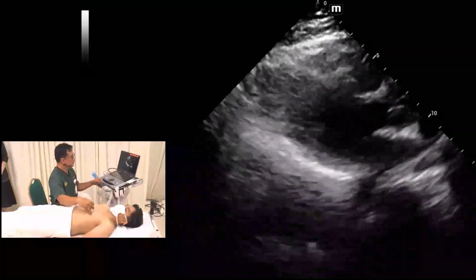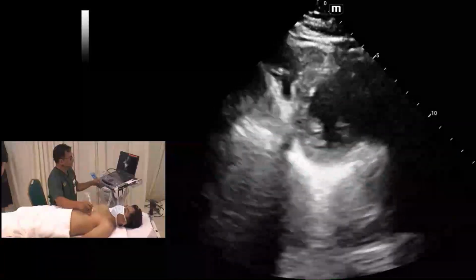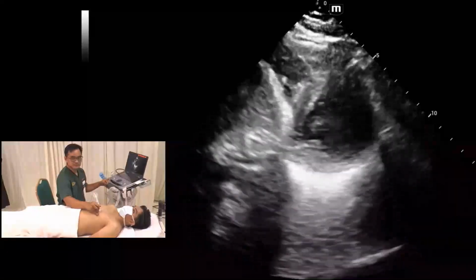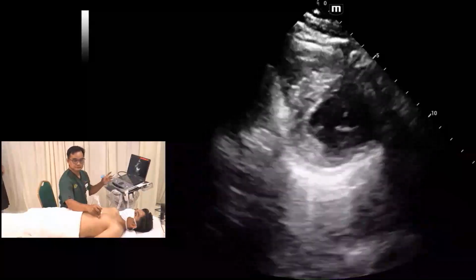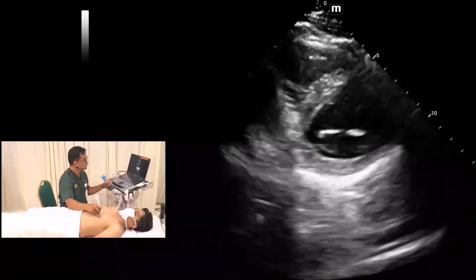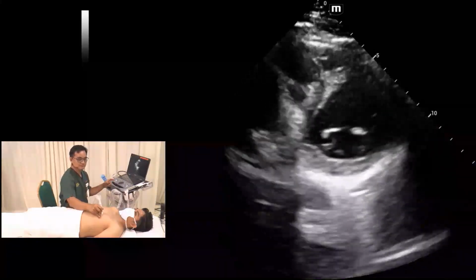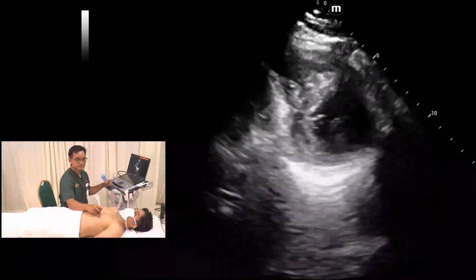This is just a subjective measurement. We do the parasternal long axis, short axis. All right. And looking at this short axis, try to look at the LV end-diastolic area in systole and diastole, and try to differentiate, because in severe vasoplegia, in the severe generalized vasodilatation, for example, in shock, the left ventricle during diastole will be normal, right? Both will be low in systole, but in diastole, in vasoplegia, it will not be.